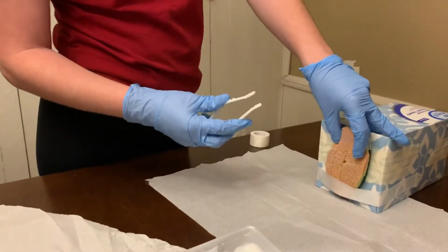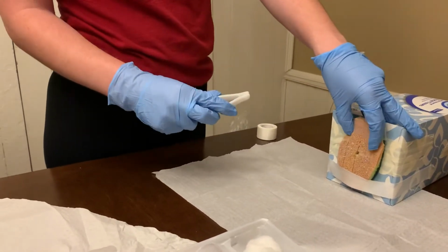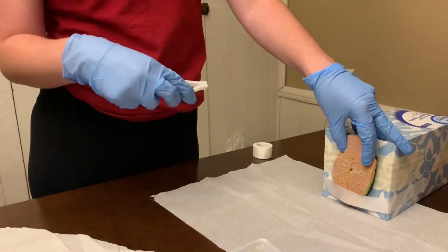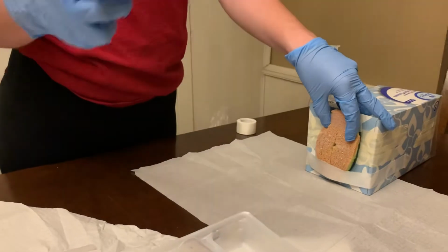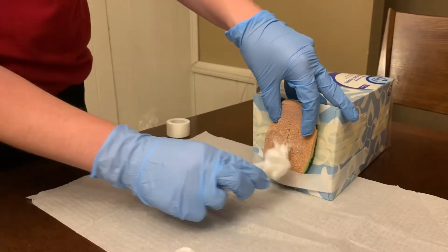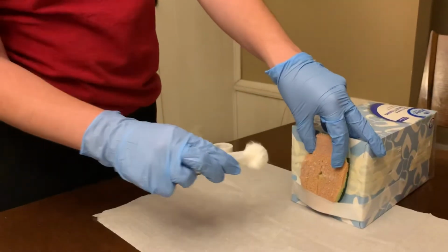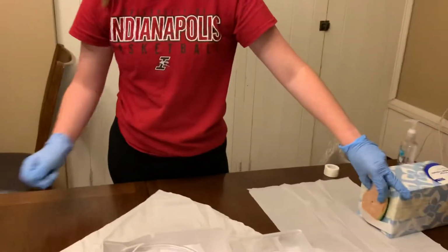On that last cotton ball, I feel like it may have touched the tip of my finger, and since this hand is considered contaminated, I would have to start the process over or get a new cotton ball for that side. But also just wanted to note that. I'm then going to take another cotton ball and clean down the middle, top to bottom. And then using one circular motion without crossing over, I'm just going to clean a circular motion around the meatus. And then I will toss the forceps and the cotton ball.